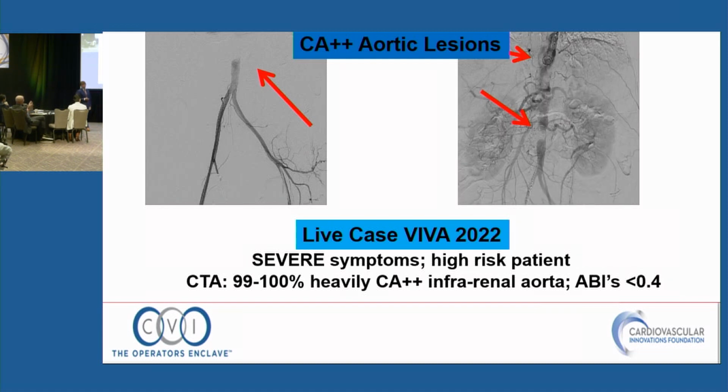So to me, one of the big features is if you're confined to the aorta itself and you can get above 10 to 12 millimeters with your stent, I think that's important. Common iliacs, if you can't get to an 8 millimeter in the common iliac, then I think you probably need to figure out a different solution, because my experience is that I haven't had very good long-term results with that.